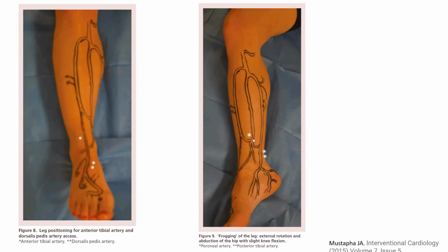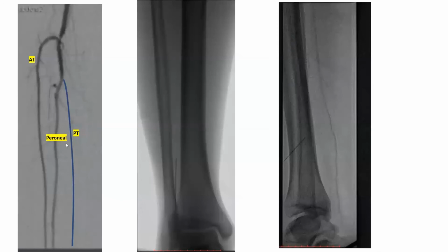The peroneal, I don't stick it like they describe here. I stick it actually like this. I stick it from anteriorly, from lateral to the tibia, from this area, the anterior compartment. I stick it through and through the interosseous membrane into the peroneal using fluoroguidance. So I use an ipsilateral view that positions me anteriorly on top of that peroneal artery. I make my micropuncture needle in line with a roadmap of the peroneal artery, parallel on top of it. Then I stick it.